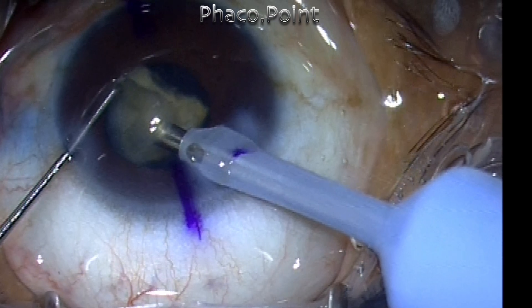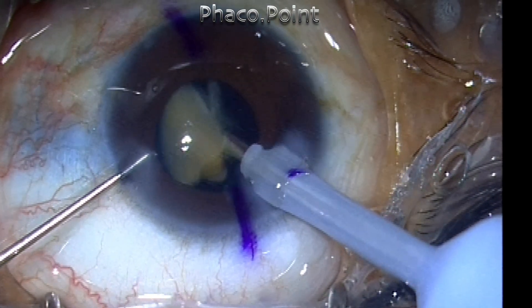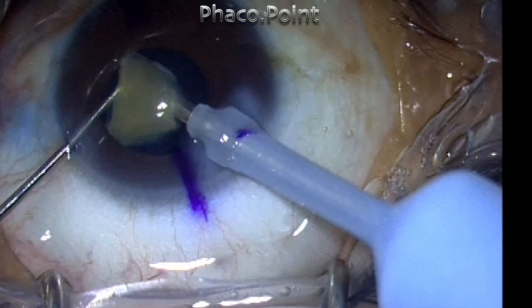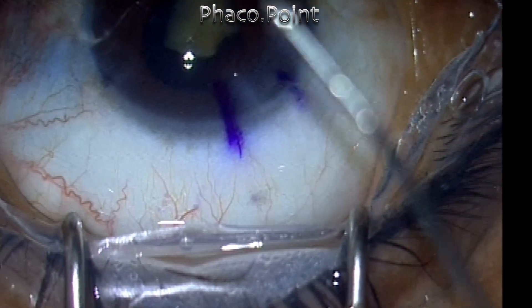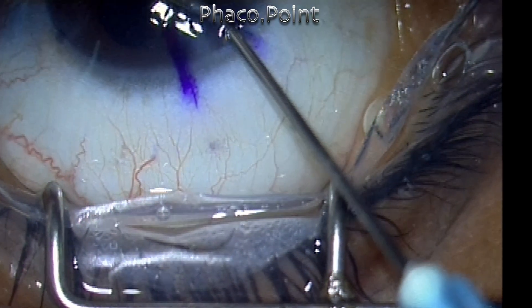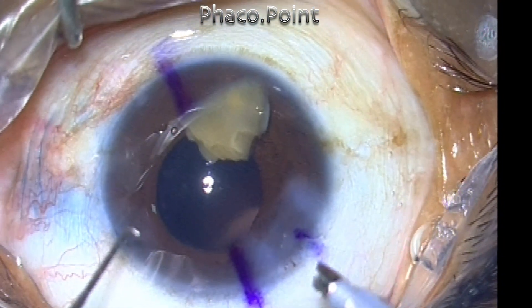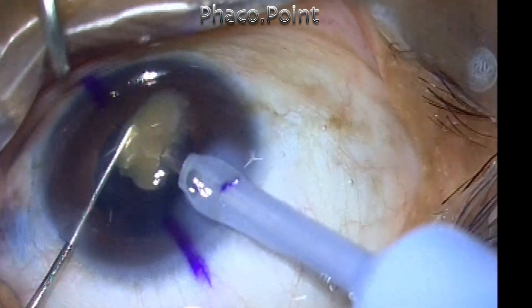Once I adopted this technique of chopping the lens, I do not find any difficulty in handling this hard Morgagnian cataract. I come to the final piece, and as I have learned from my mistakes in the past, I go out and fill the chamber with viscoelastic. The methylcellulose will replace the balanced saline solution — it is a much more viscous fluid and will counteract the surge while removing the last piece. There is also much less risk of damaging the posterior capsule while evacuating the final fragment.